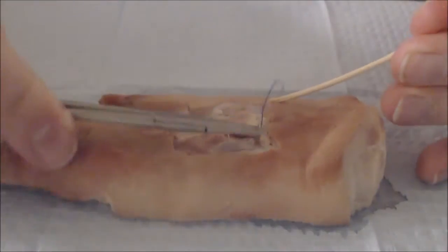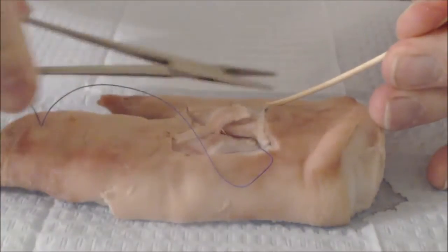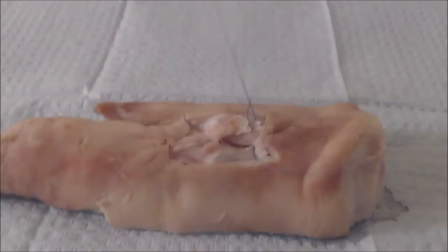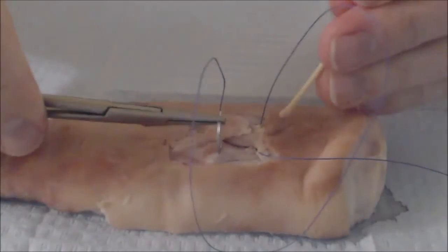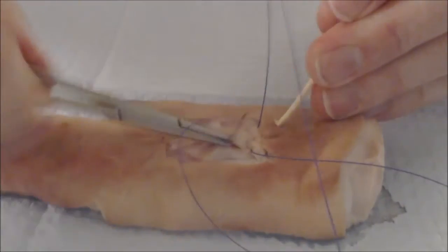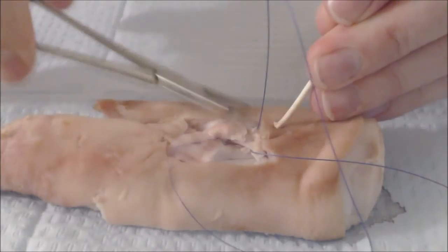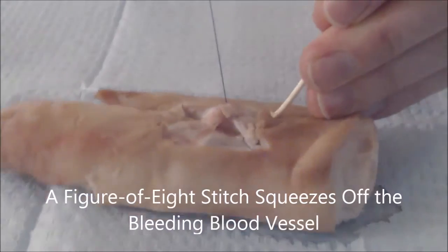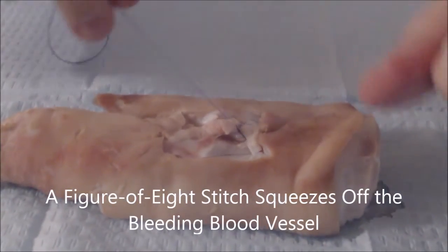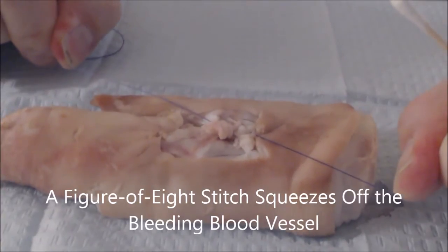In order to start this, go to one side of the bleeding and put a simple suture in, and then go to the other side where you think the bleeding is coming out of, and do the same thing. The figure-of-eight is going to give you a tamping-off type of scenario where it will squeeze off the blood supply in the center and then stop your bleeding.